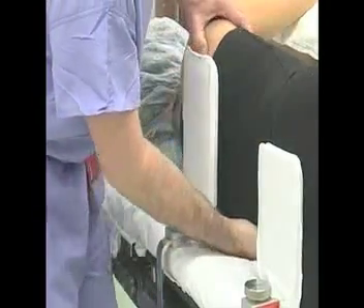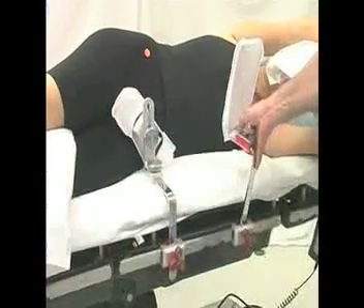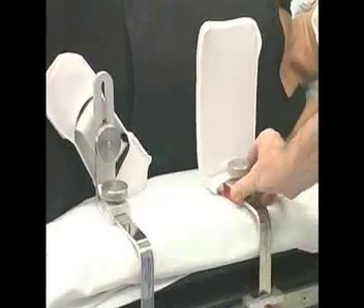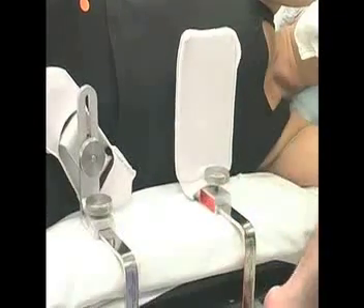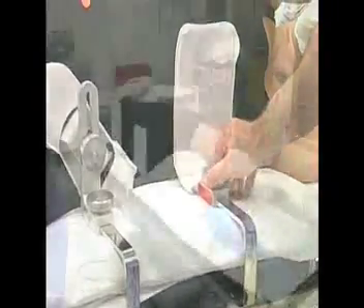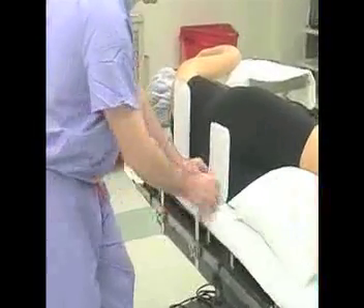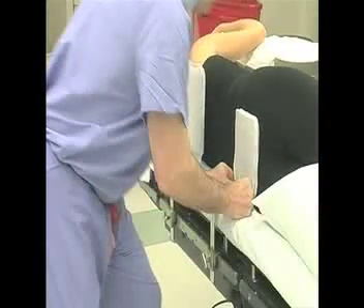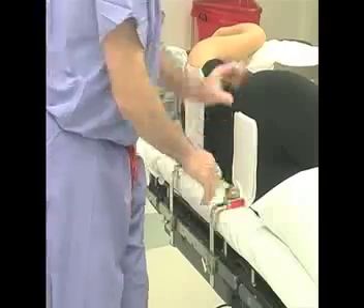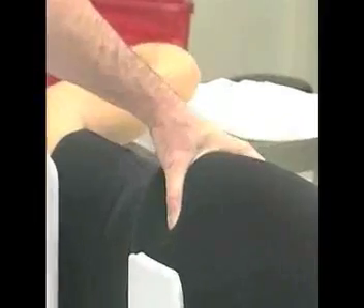Place a medium or large flat upright support with a small L bar just below the tip of the scapulas. Slide the chest posteriorly against the support to again keep the patient close to the surgeon. The flat anterior chest support is placed just inferior to the woman's breasts, taking care not to trap the breast under the support. The flat anterior chest support on a man is placed just inferior to the nipples.